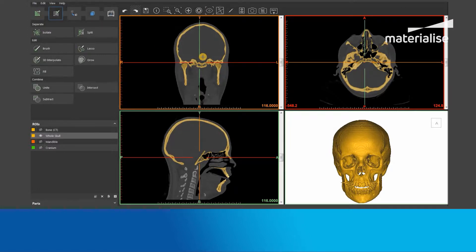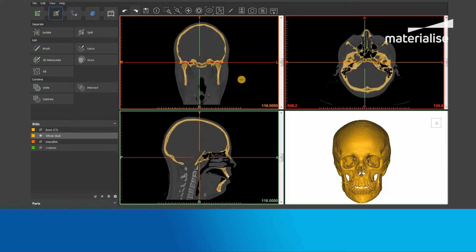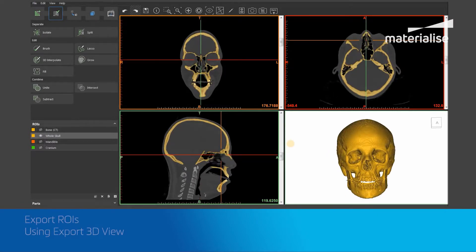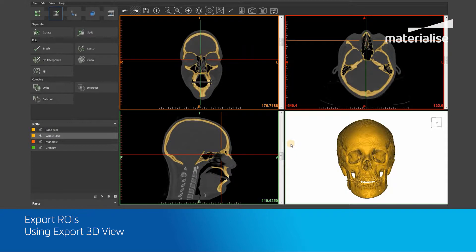You can use case-relevant ROIs or parts as inputs for these tools. First, I will show you how to use the Export 3D View tool.